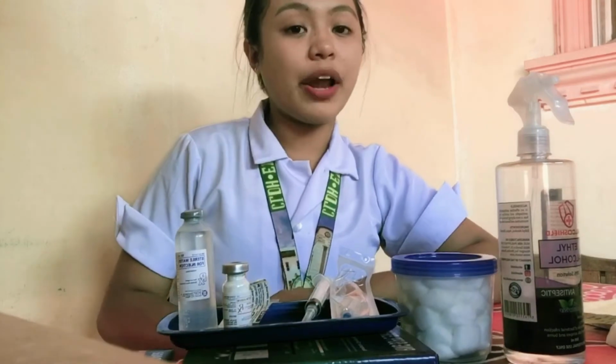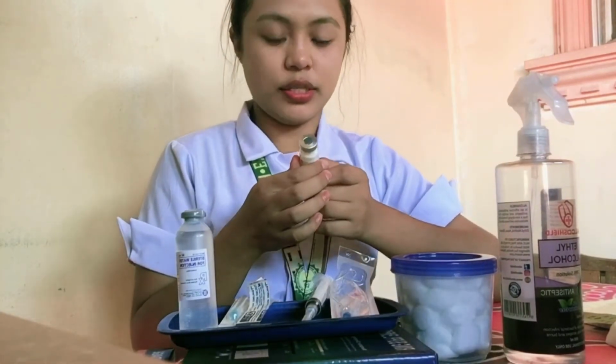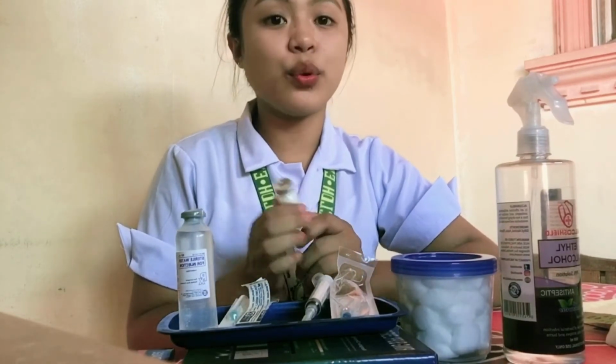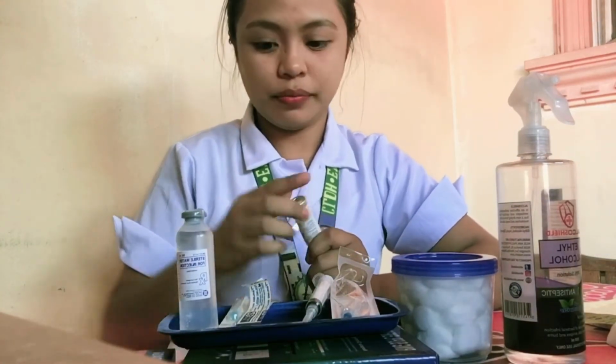After preparing the syringe, we need to get our powder vial and read its manufacturer's direction. It says here that we need to input 3 ml of sterile water.